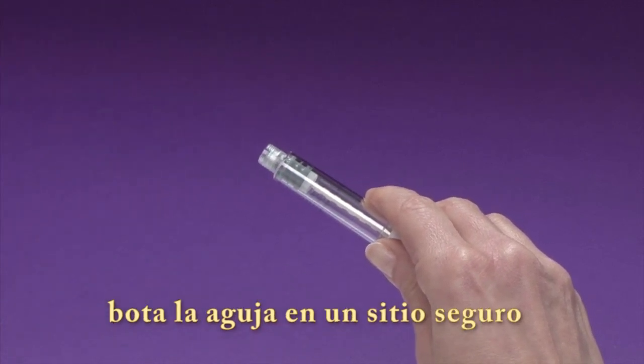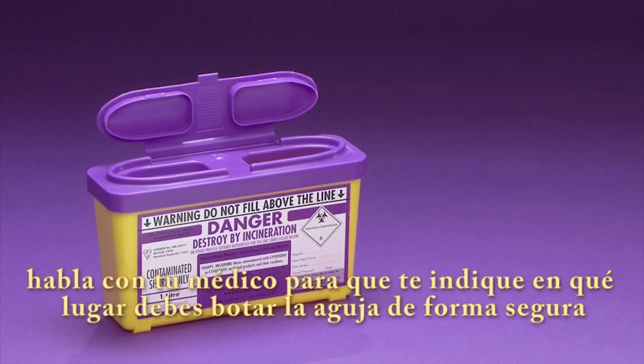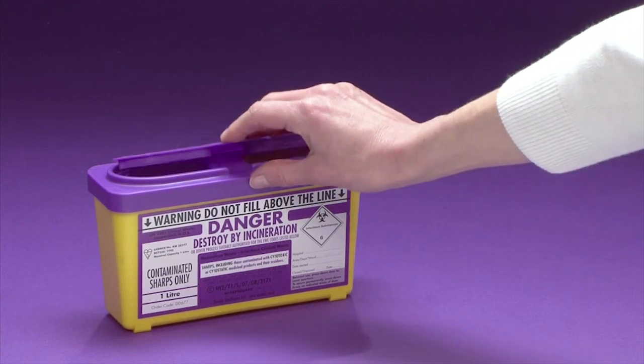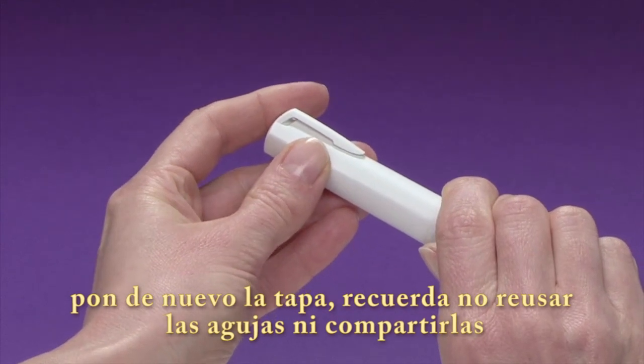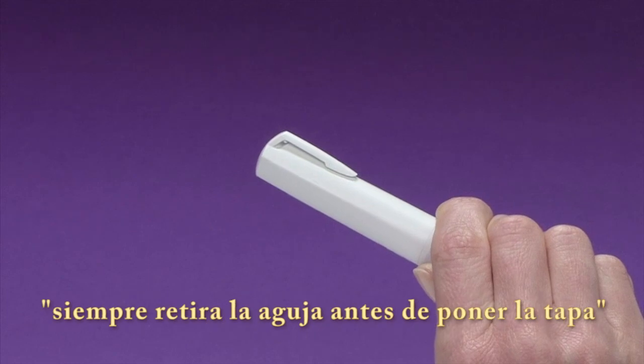Dispose of the used needles safely. Ask your healthcare provider how to dispose of needles that are no longer required. Now, put the pen cap back onto the pen. Please remember never to reuse any used needles. Also, never share needles.